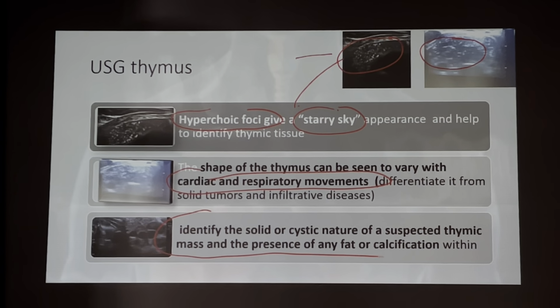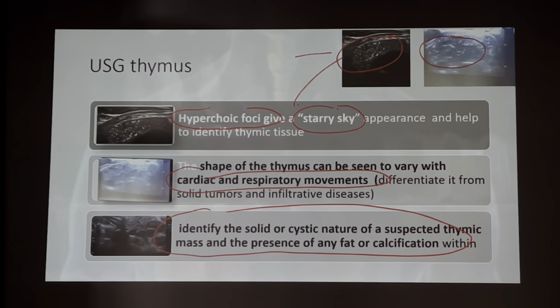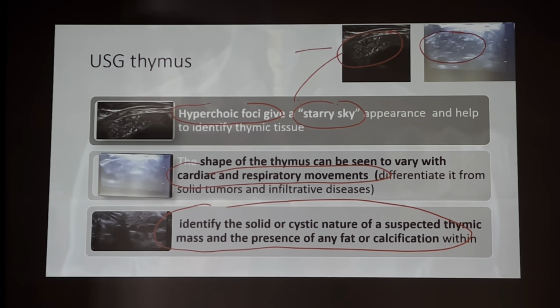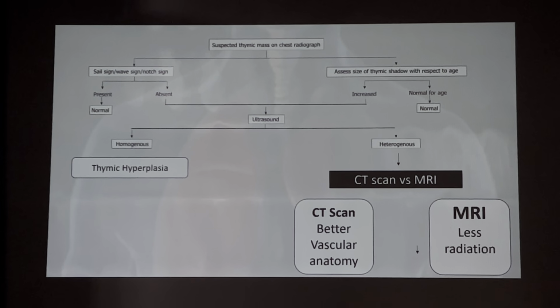Also in ultrasound, we can identify whether it is a solid or cystic swelling inside the thymus. Is it a mass, or is there some fat, some calcification inside? So that is the beauty of ultrasound when we talk about the thymus.